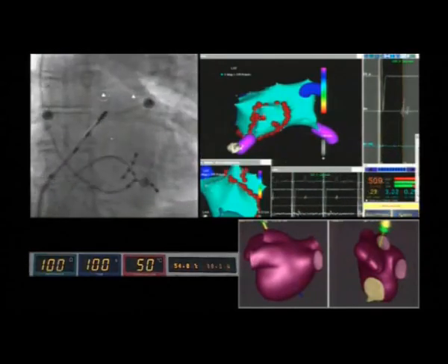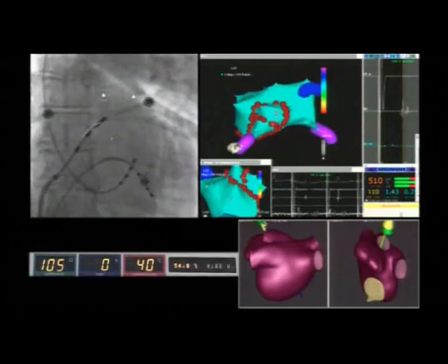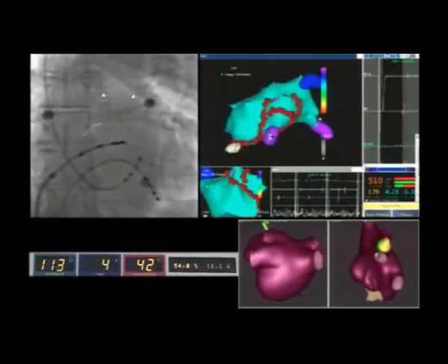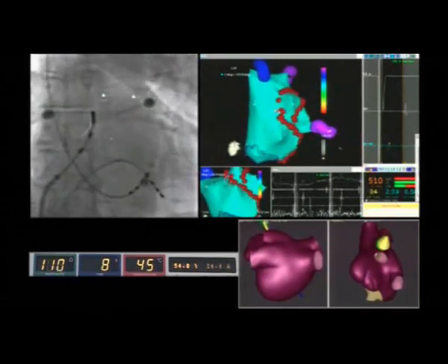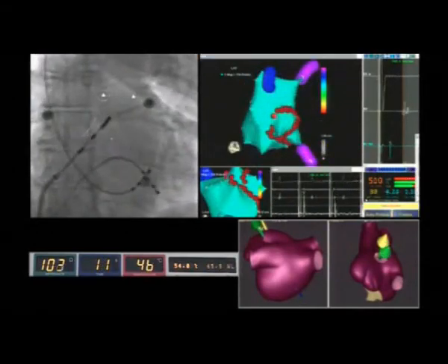There are variants such as a common ostium or additional pulmonary veins. The ridge between the left atrial appendage and the left superior pulmonary vein is a challenging site, and if narrow, its ablation may result in residual gaps.